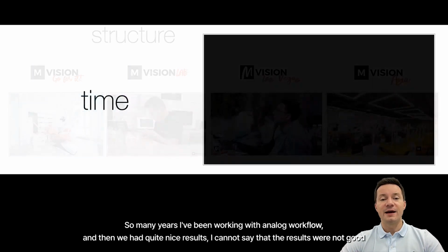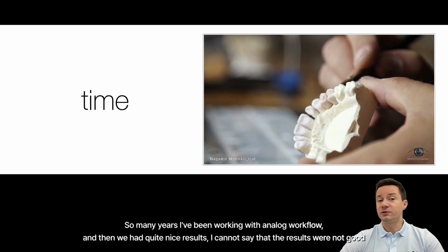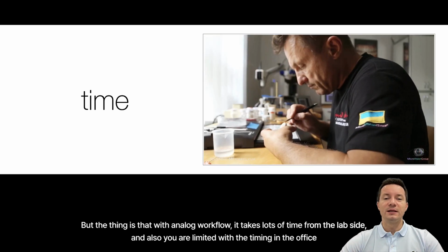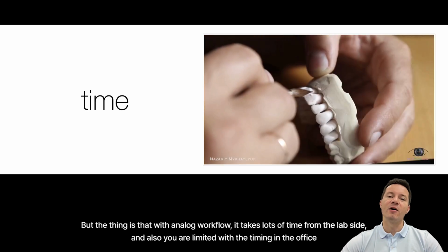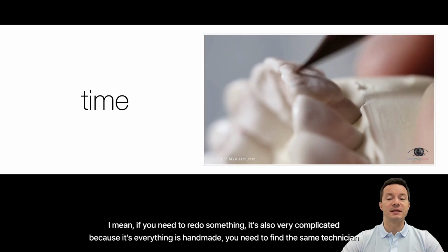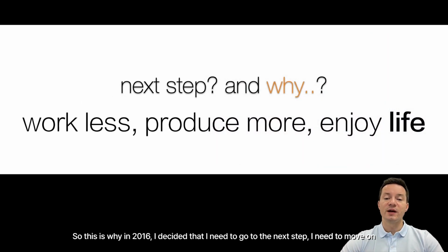So many years I've been working with the analog workflow, and we had quite nice results. I cannot say that the results were not good, but the thing is that with the analog workflow, it takes lots of time from the lab side, and also you are limited with the time in the office. If you need to redo something, it's also very complicated because everything is handmade. You need to find the same technician, so you have quite a lot of limitations. So this is why in 2016 I decided that I need to go with the next step. I need to move on.